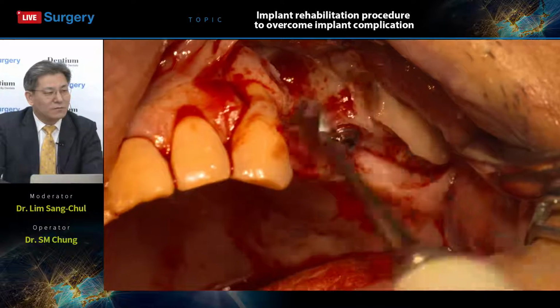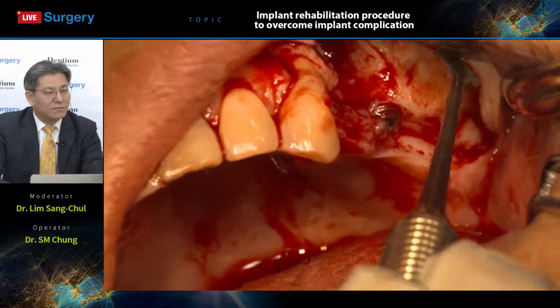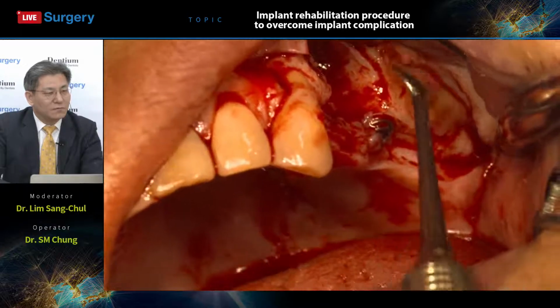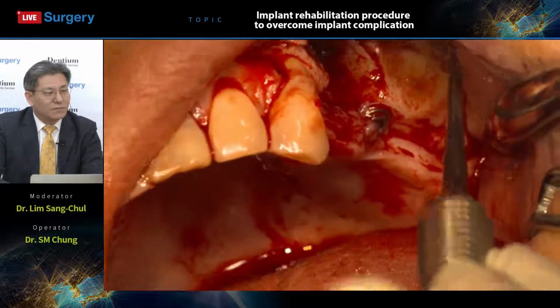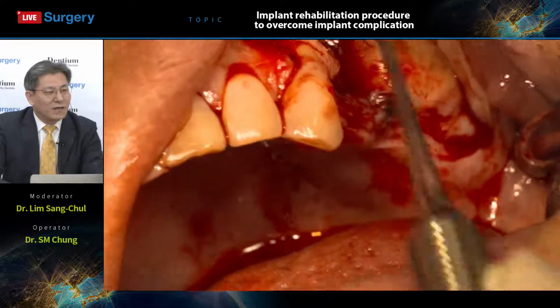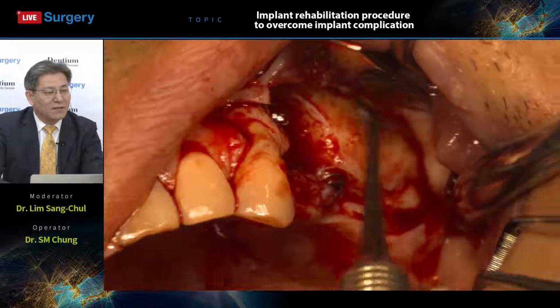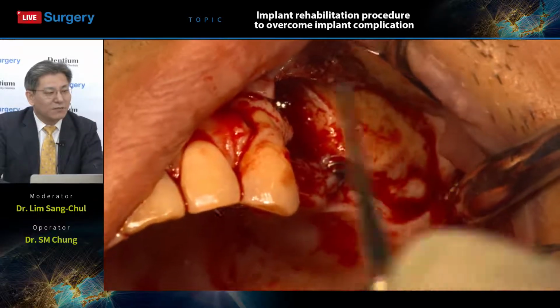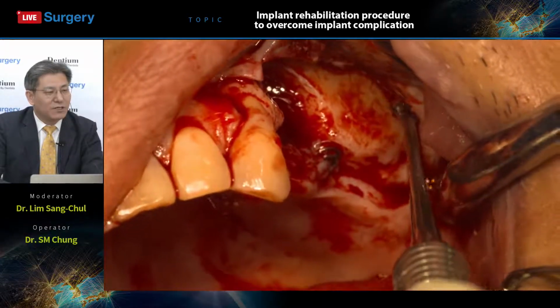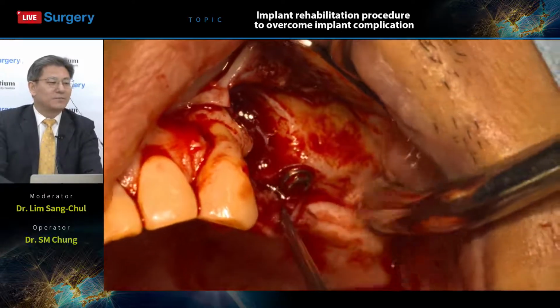And you must also do a sinus elevation, approaching to the labial side and raising the flap a little bit. He is going to have a lateral approach for sinus augmentation, so a full thickness flap is reflected from this posterior maxillary area of the labial bone. Okay.